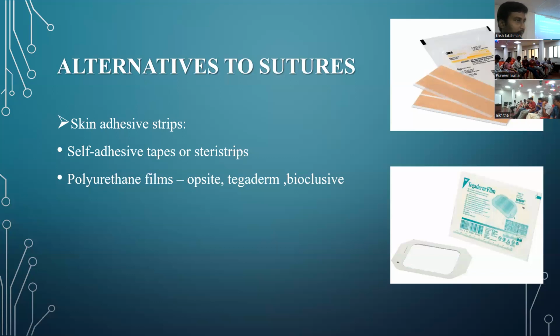And second thing is, always in a stepping, make sure your instrument is looking down rather than trying to step like this. That is because when you're looking down and you throw the second knot, it will slip off the instrument. Rather than if it's like this, if the knot gets stuck, you can't remove it. You end up struggling in the fluid, you're actually damaging the tissue. You're making the knot less secure at that point of time by damaging the tissue.